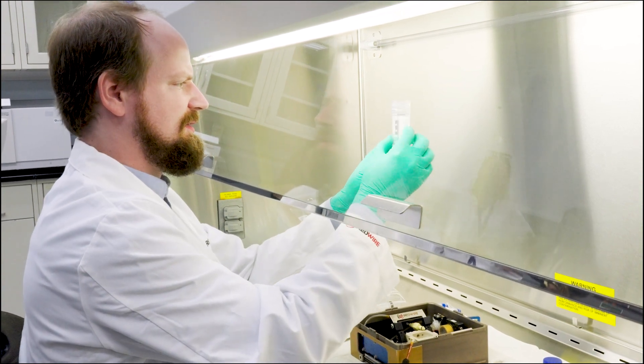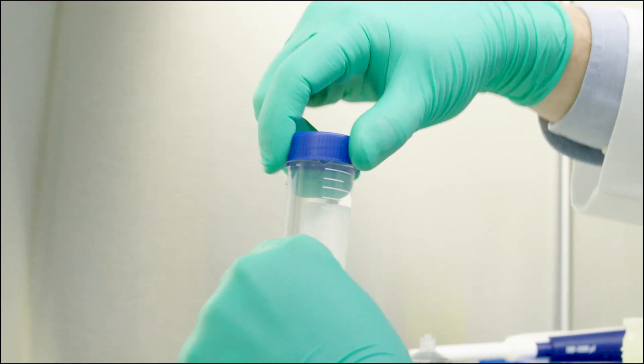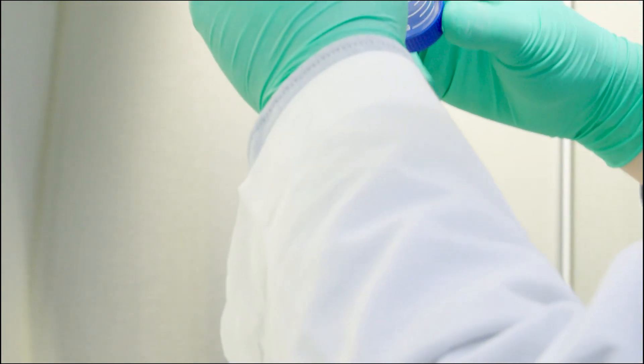And there we go. We got a piece of meniscus tissue in a tube. This was printed on the ISS, cultured, and then brought down to Earth and survived, and I'm holding it right here. I'd say it was a very good success.